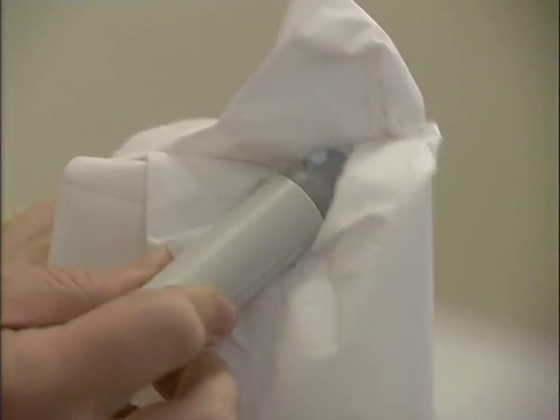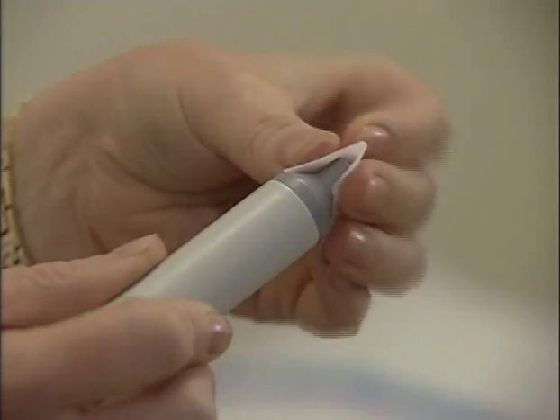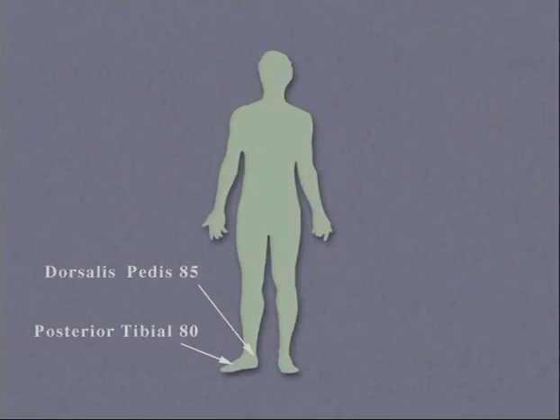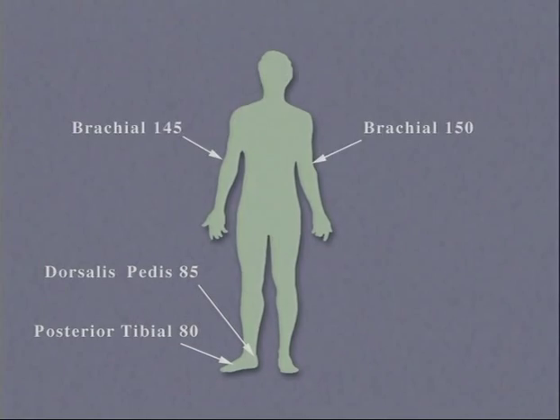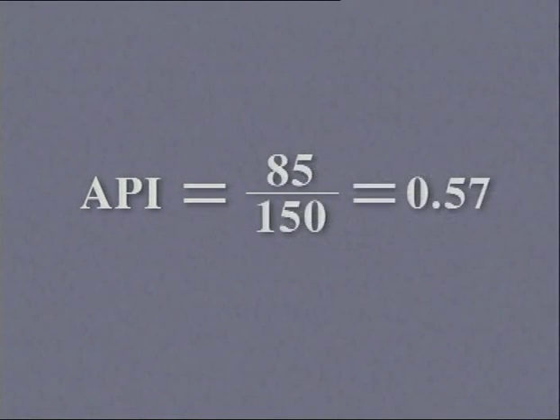Having completed the examination, excess gel is wiped from the Doppler probe immediately after use. The probe is cleaned with an alcohol impregnated wipe to reduce the risk of cross-contamination. In this example, the ankle pressures for the right leg were 80 and 85 and the brachial pressures were 145 and 150. The ankle pressure index is calculated by taking the higher ankle pressure reading of the two pulses in one leg, that is 85, and dividing it by the higher brachial pressure reading, in this case 150. The API is therefore 0.57.